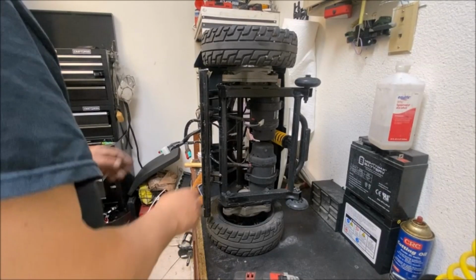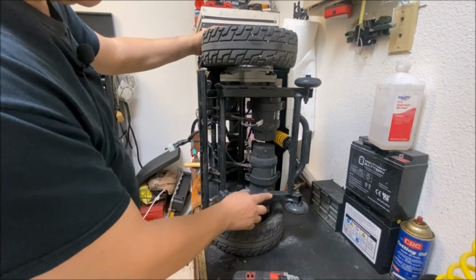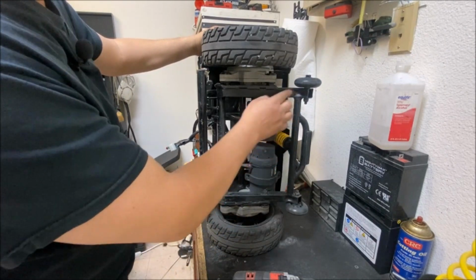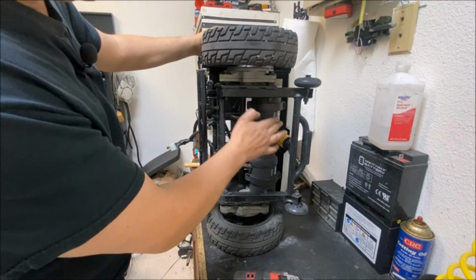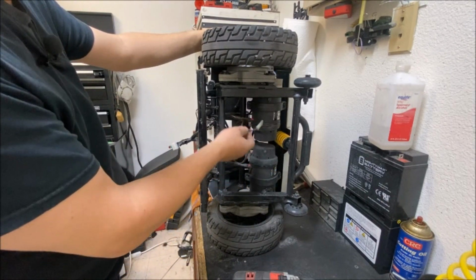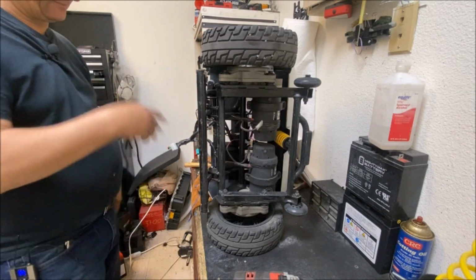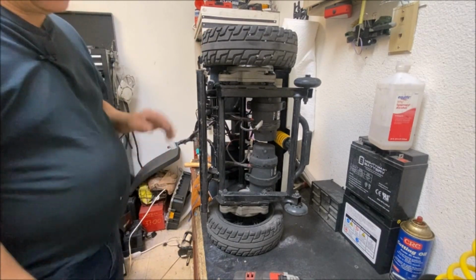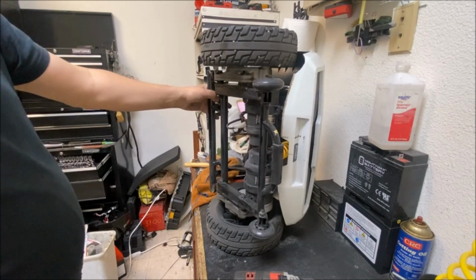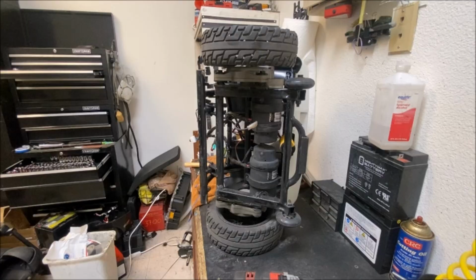Alright, time to move on to the rear section. It looks like a bit where surface water's got to it, so I'll just advise them about that. Just be careful going through any water. I've got to tie that back a bit better, and take the shroud off, give it a good clean up, and hopefully that's it. Just go onto the seat and get that done next.